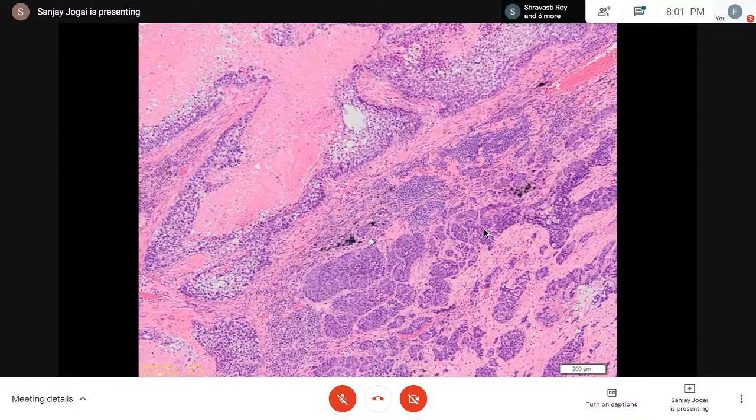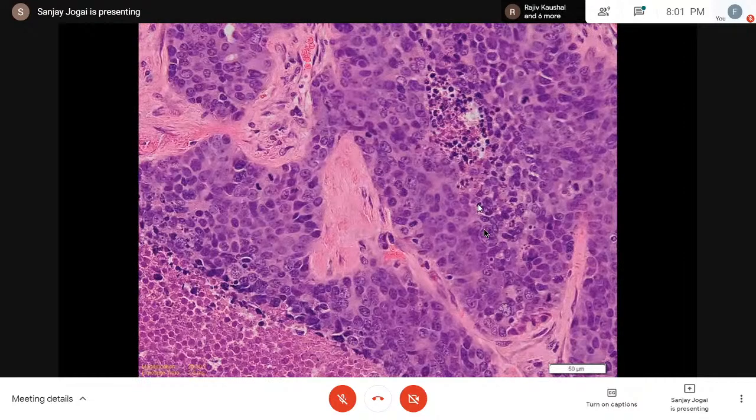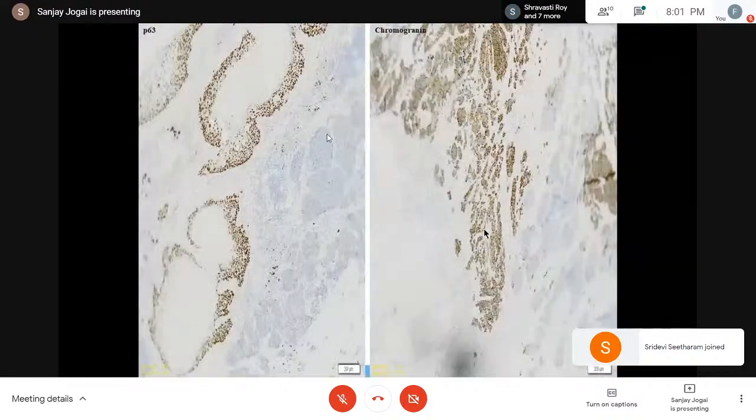So this is how the lobectomy looked. It's almost reminiscent of the previous case to some extent. You have areas here which are highly necrotic with slightly more cytoplasm, whereas cells here look more organoid, more bluish, with a neuroendocrine look. On high power you have similar spindly cells with a stippled chromatin pattern. There are other areas where the cytoplasm is more abundant, the cells have started becoming nucleolated, and you have brisk necrosis and a lot of apoptosis.